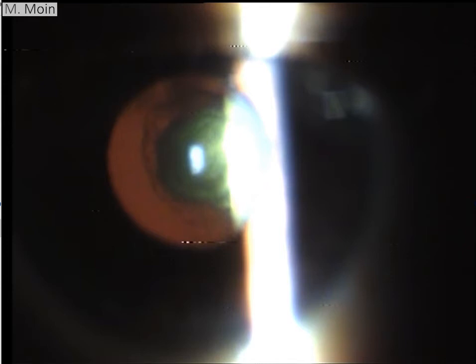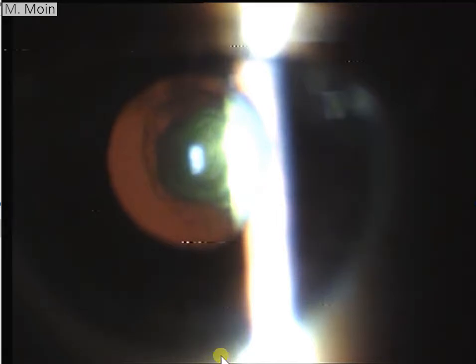Welcome to this video on slit lamp examination in which we are going to show you a posterior polar cataract. So let's look at what we are looking at in this patient.